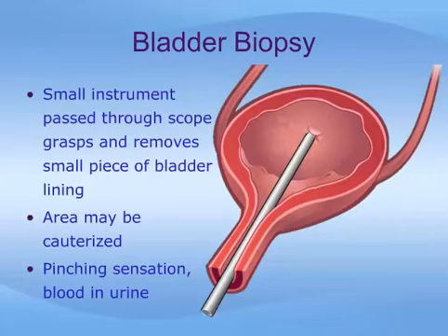During a bladder biopsy, you may feel a pinching sensation, and afterwards you may notice blood in the urine for a short time.